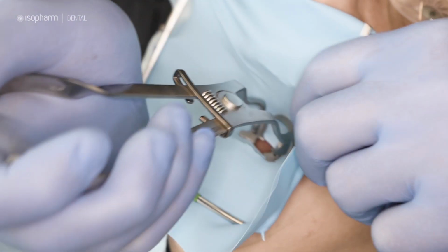Okay, tip number two, isolation. Now, we all know that rubber dam is mandatory for root canals. It speeds up the treatment, gives you better access, it's more comfortable for the patient, and of course it protects the airway and keeps the area nice and clean and dry. But it's difficult to place, right? Well, here's a video that shows how rubber dam can be placed quickly and easily.